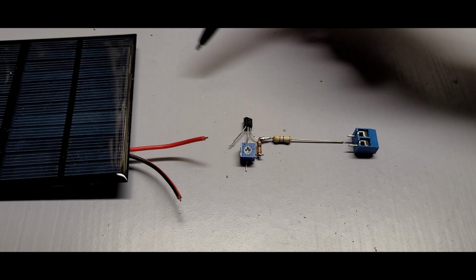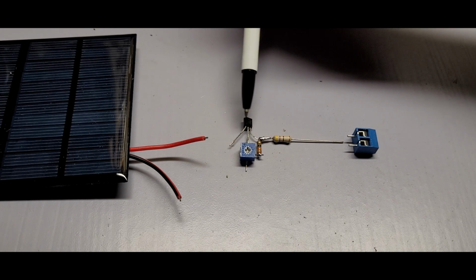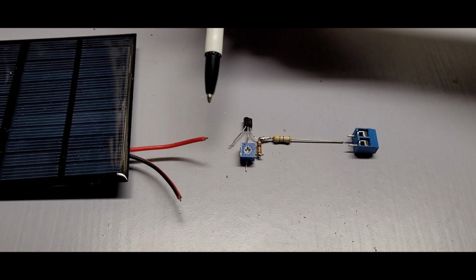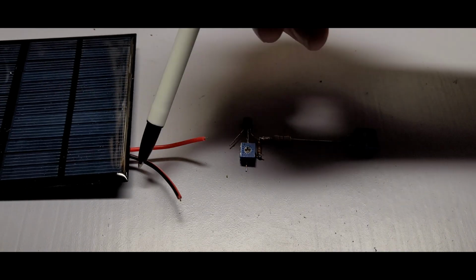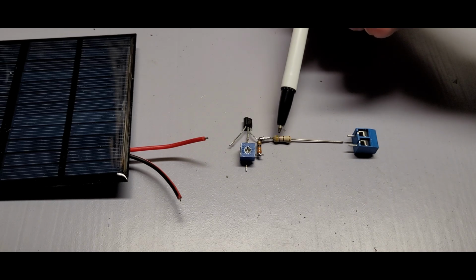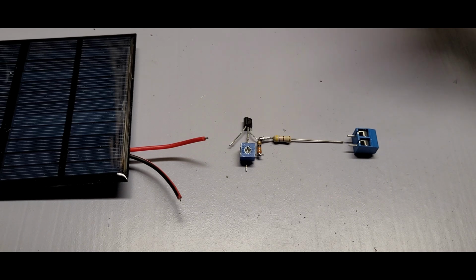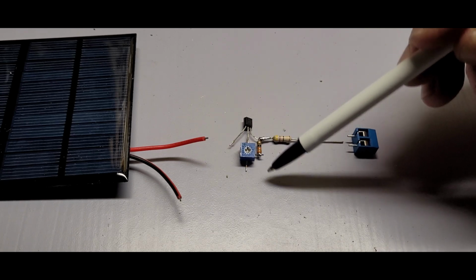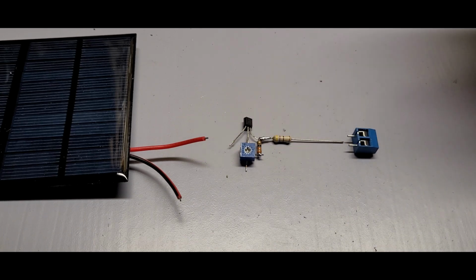All right, if you can believe it, that's about going to do it. So our little current regulator here has one lead that hasn't been connected. That will go to the positive lead coming from the solar panel. And the negative lead from the solar panel will connect to one lead of the wiring block. And the 470 ohm resistor will connect to the other lead on the wiring block, and then we're done. The final lead here on the potentiometer that's sticking out the bottom is unused. You can trim it, or you can just leave it as it is.